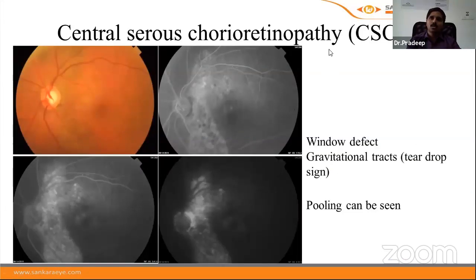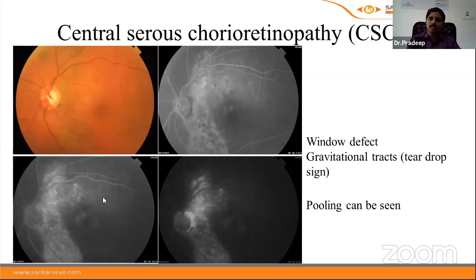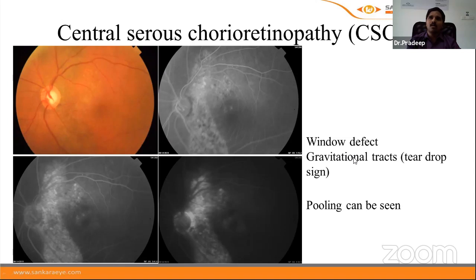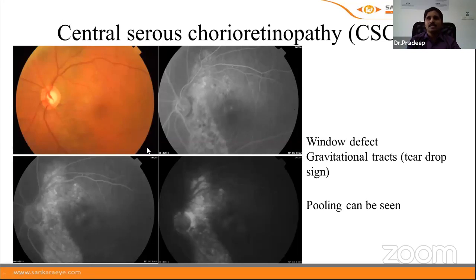In chronic CSCR, a window defect is seen — hyperfluorescence size constant, intensity initially increases then decreases. A window defect in the shape of a gravitational track or tear-drop sign is characteristic of chronic CSCR. Some areas may also show pooling. Areas of RPE hypertrophy or hyperplasia in CSCR appear as blocked fluorescence.